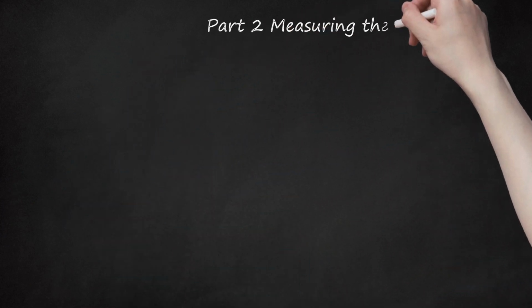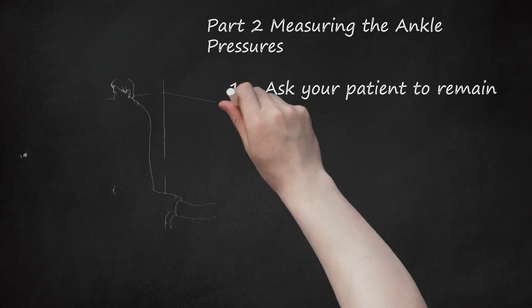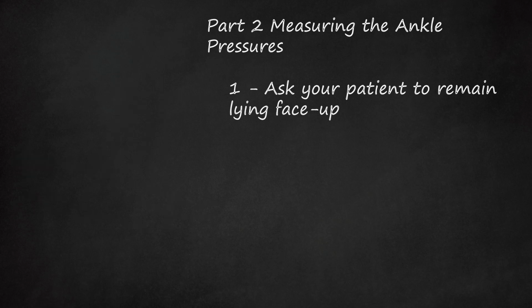Part 2: Measuring the ankle pressures. 1. Ask your patient to remain lying face up. The goal is to keep his arms and legs at heart level so as to get the most accurate blood pressure reading. Remove the blood pressure cuff from your patient's arm.